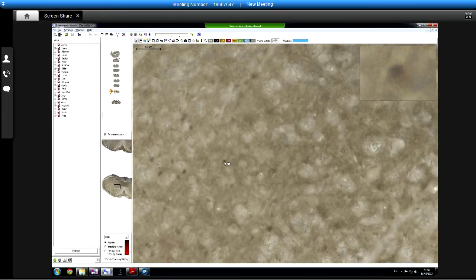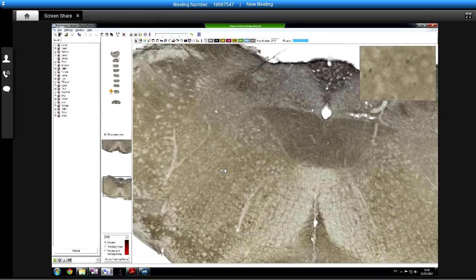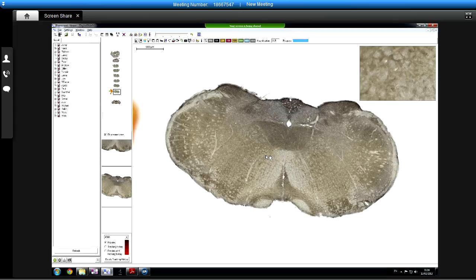So, the first thing with histoquant is it works on areas you mark. There is the option to run on the entire slide, but the best way to do it normally is to work with areas that you mark. So, in your case, that might be where we just draw around each one of the sections. It's just like 5 marks on the slide if there are 5 sections. Have you already marked this up at all?